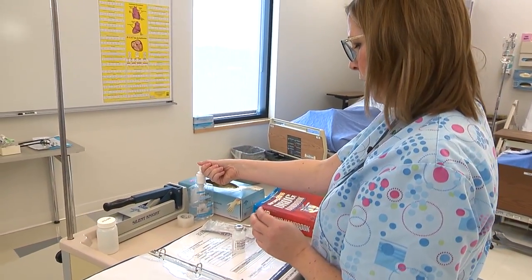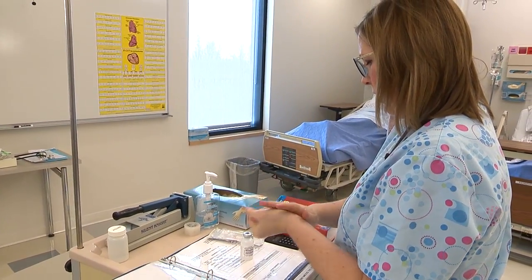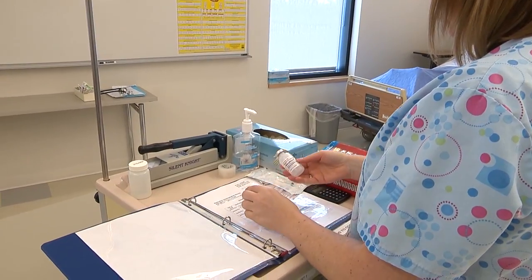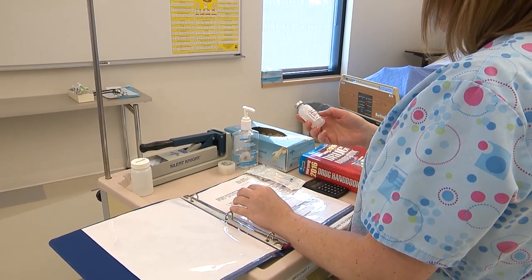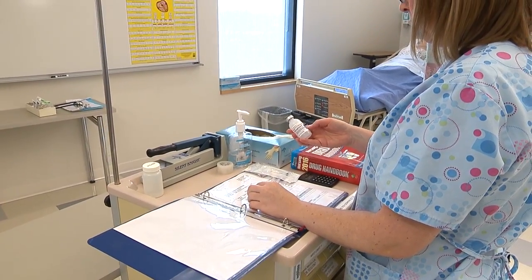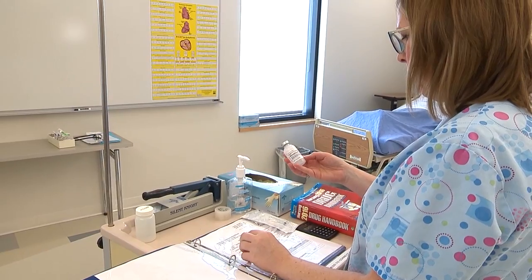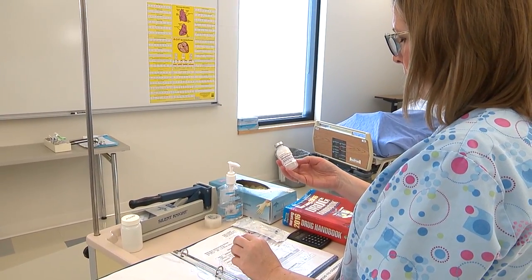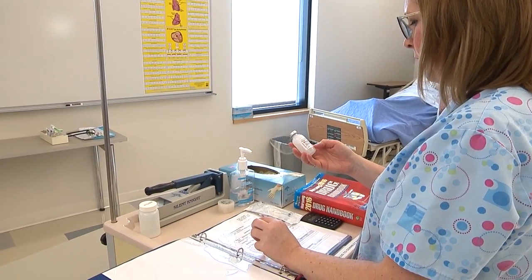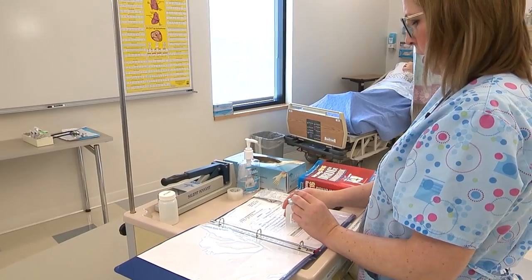Now I'm going to perform my second check. I have Morgan Brown, date of birth 8-4-70, no known allergies. I'm going to give morphine sulfate injection, 2 milligrams IV push every 3 hours. I have 2 milligrams per ml here, so I'm only going to give 1 ml. Expiration date of 12-20-50. The time is now and I will document later.